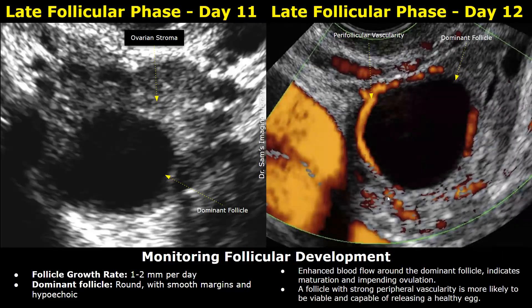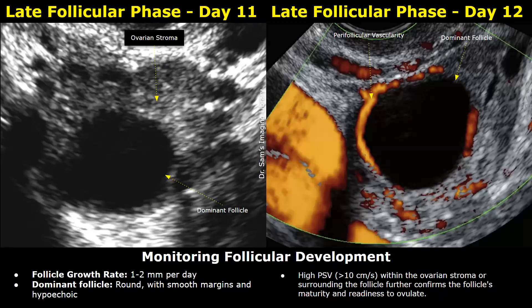On power or color Doppler, enhanced vascularity seen around the dominant follicle is a good sign indicating maturation and impending ovulation. A follicle with strong peripheral vascularity is more likely to be capable of releasing a healthy egg. If perifollicular vascularity is absent, it may indicate a failure of ovulation. A peak systolic velocity of 10 centimeters per second or greater within the ovarian stroma or surrounding the follicle further confirms a successful impending ovulation.